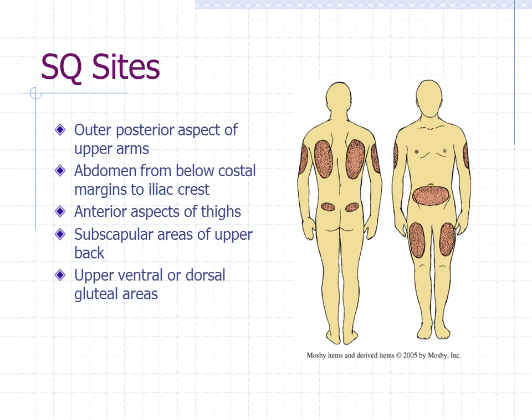The abdomen is going to absorb more rapidly than the thighs. In the abdomen, make sure that you administer your injection at least 2 inches away from the umbilicus. And if they're going to be repetitive injections, make sure that each injection is at least 1 inch away from a previous site. When I administer insulin to a patient, I usually try and administer it in sites that the patient does not have ready access to, to save those sites for the patient when they're at home administering themselves.